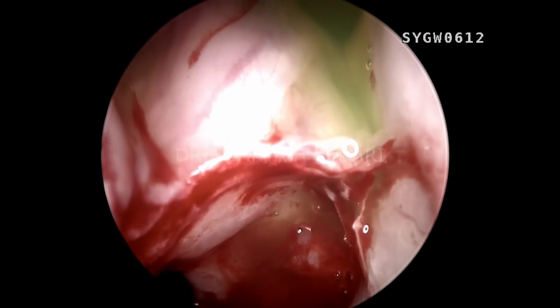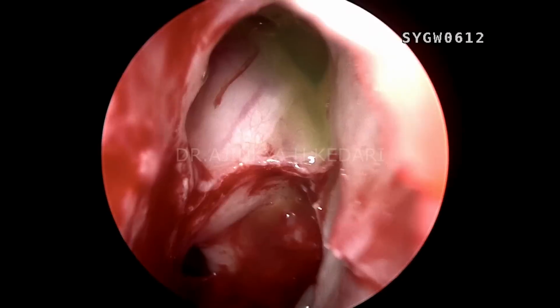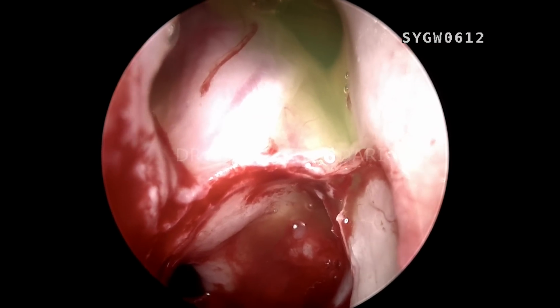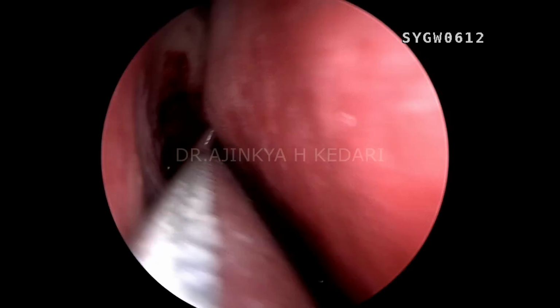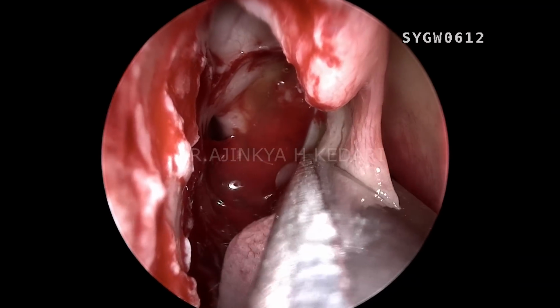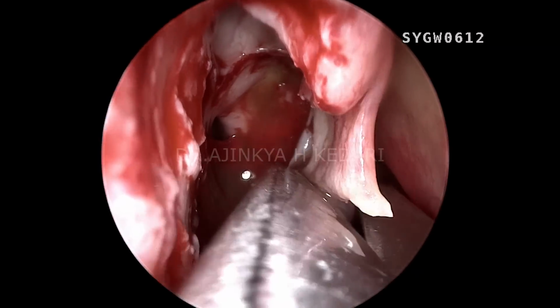But what you can see here, that's the frontal lobe prominence. You can see very clearly. That's the frontal sinus, what you can see right now. This is still a 0-degree endoscope, and because of the debridement of all the tissues around, I can actually see with a 0-degree the entire lower half of the frontal sinus.